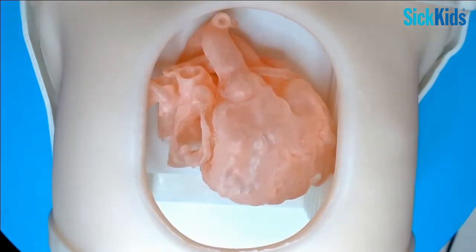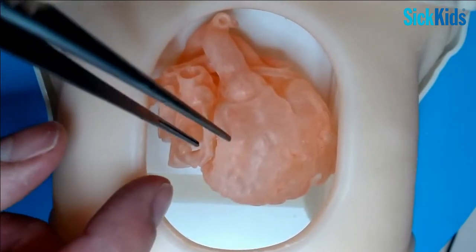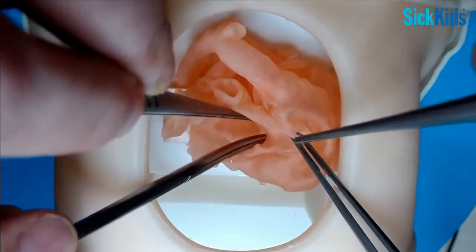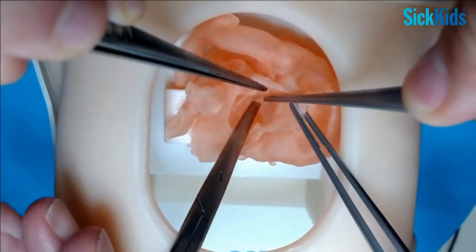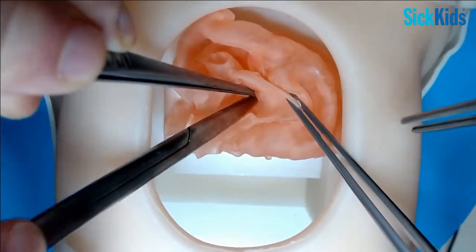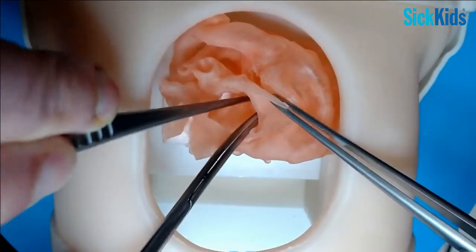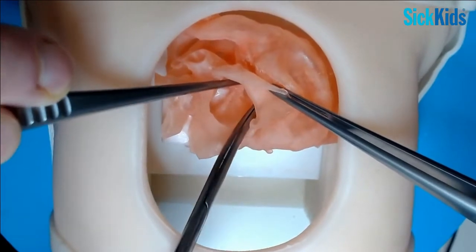The first thing, in a case like this, is you open the right heart and look to see if you get a reasonable assessment through the tricuspid valve - looking through the tricuspid valve at least gives you an idea. You can just see the VSD there - it's perimembranous to an extent. But trying to retract the tricuspid valve enough to see the outflow tract is quite difficult.